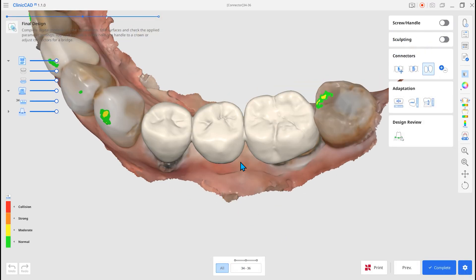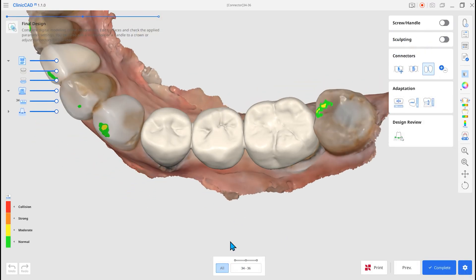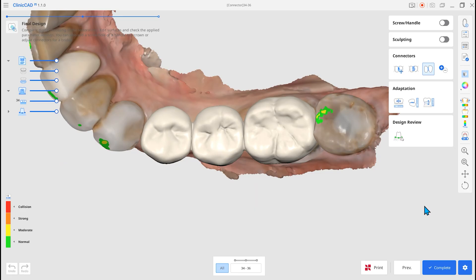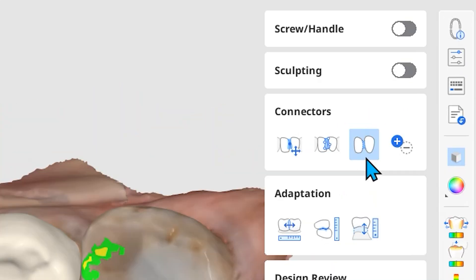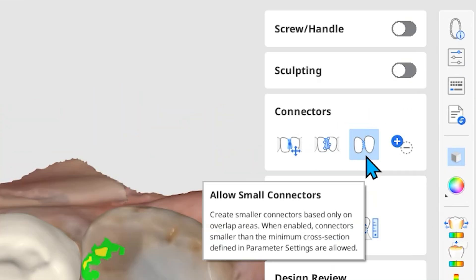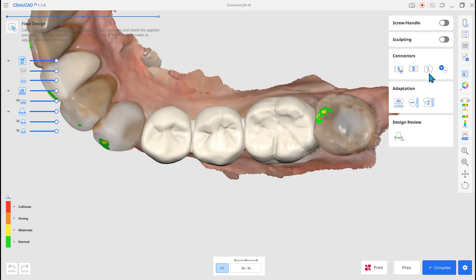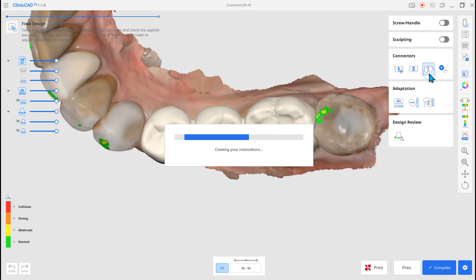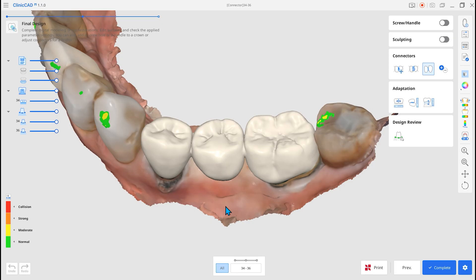Fourth, new types of connectors are added. In Final Design, select the Allow Small Connectors option to minimize the connector area.